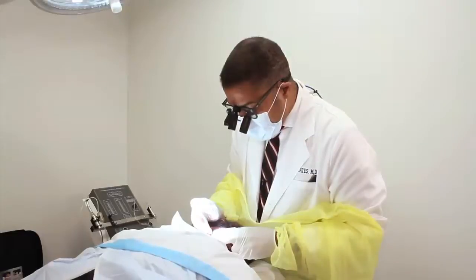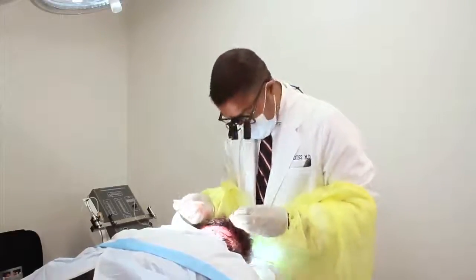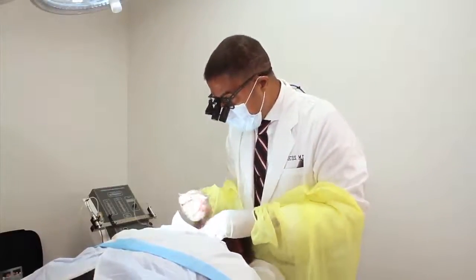To be a really proficient hair surgeon, you have to learn how to do a lot of different techniques — the cold punch, the Harris punch, and then let's talk about the Neograph.